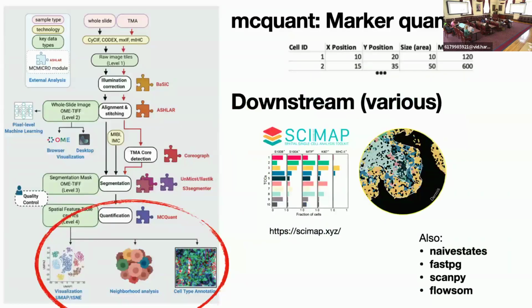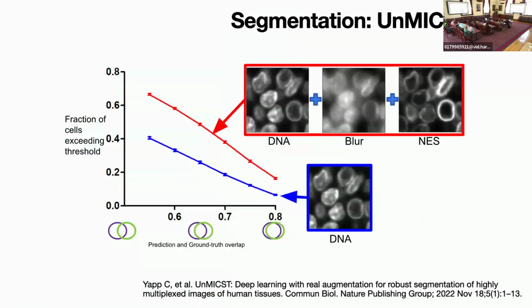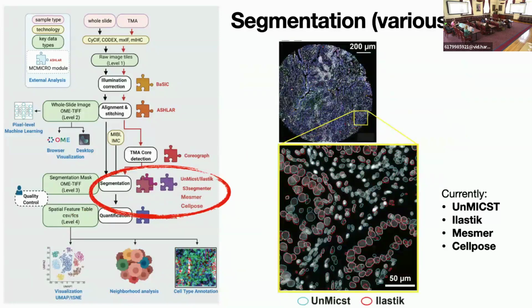So now that we've got segmentation boundaries for all the cells. Oh, one thing I should say is that another challenge here is that nuclear segmentation, because we've got a DNA stain everywhere, every cell almost has DNA. Segmenting the nucleus is achievable. Segmenting the cytoplasm is a lot harder, or other organelles, because there isn't one universal plasma membrane marker for all cells. The best we can do is find as much coverage as we can for the cells we care about and add them to the experiment, but it can be tricky.